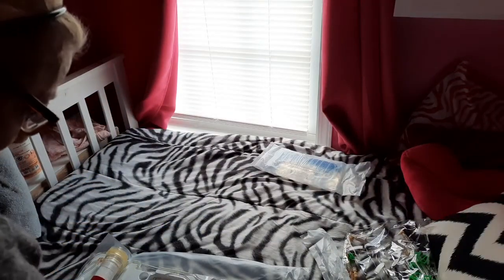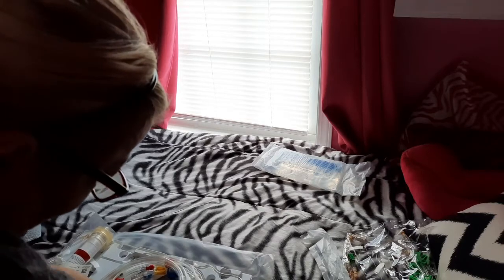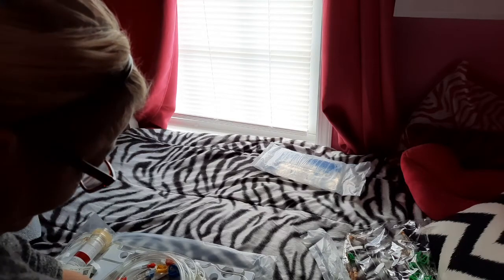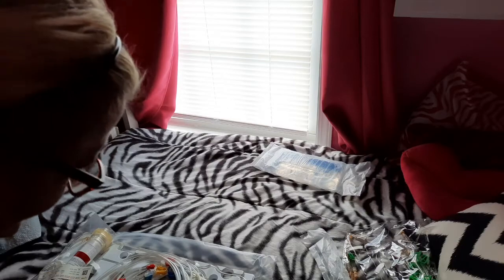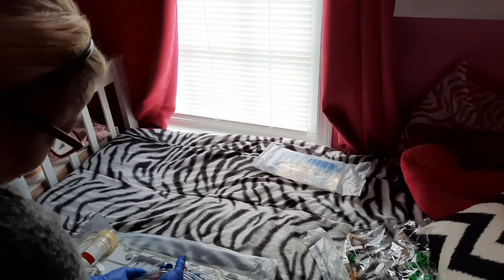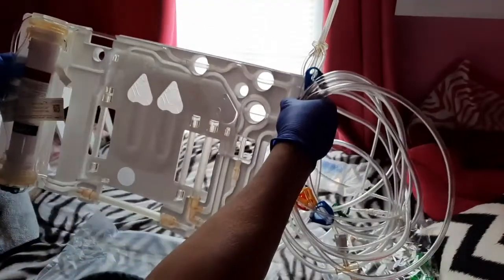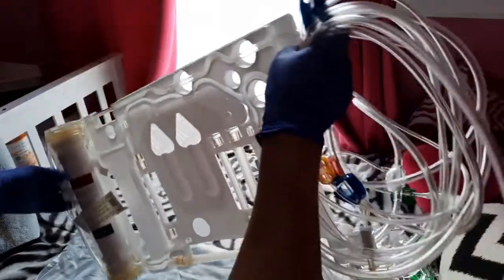So what you want to do is, there's a little line holder right here. You want to get these lines out of there to free them up, and just tear that piece off. It comes right off. You're going to grab your cord, like so, and then grab your cartridge, and we're going to walk it over to the cycler and slide it in. I'll be right back.